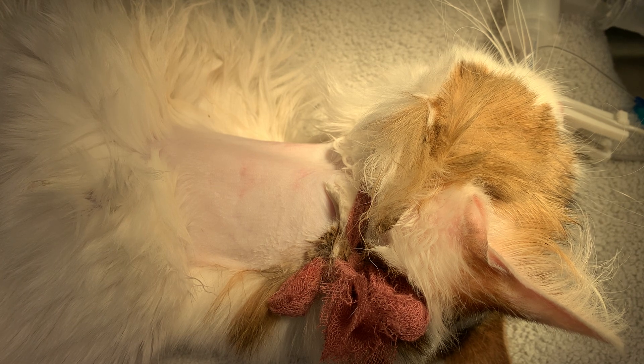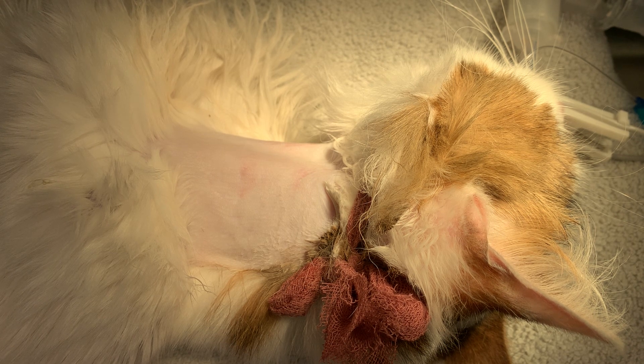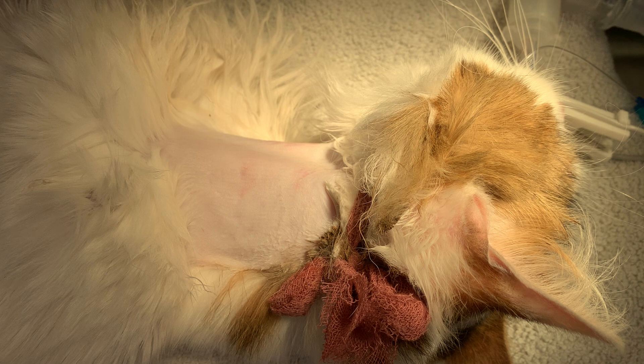Hi everybody, this is Dr. Wardwell at All Pet Complex. Today we are placing an esophagostomy tube on a cat. He's actually one of our staff members' cats and he has a presumptive diagnosis of inflammatory bowel disease. It's fairly severe — he's losing a lot of weight, he's borderline hypoalbuminemic, and won't readily eat our preferred diet. So we're going to go ahead and place an e-tube on him to support him while we start some other treatments.